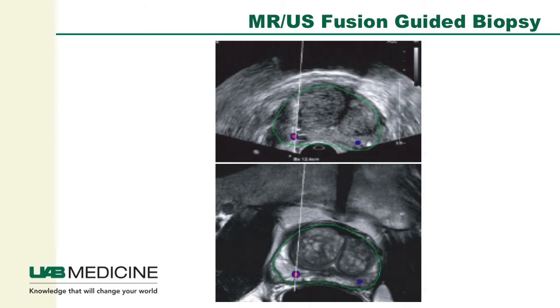Here on this screen, we show a split screen of the transrectal ultrasound with the simultaneous fusion to the T2 weighted image derived from the diagnostic MRI the patient had done a couple weeks prior. As you can see, there's a target which was previously denoted by one of the MR radiologists and ourselves in the multidisciplinary conference in the lower part of the screen. That's identified, and it is snap fused to the real-time ultrasound that is performed that actually guides the needle core into that target.